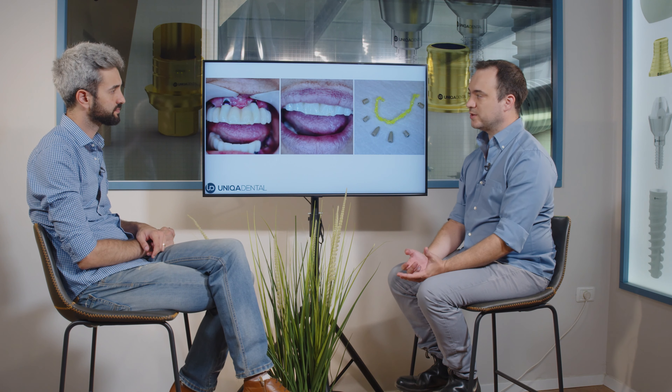I see it got a purple pinkish color. The angulated multi-units were anodized so they stick out a little less. But in the smile line you don't see the multi-units, so in this case it's fine. Either way, you don't really have an option — taking out those implants, making bone augmentation, and replacing them is a very hard, very big procedure, and it can end with major aesthetic flaws. So it's not the best thing to do in this case.